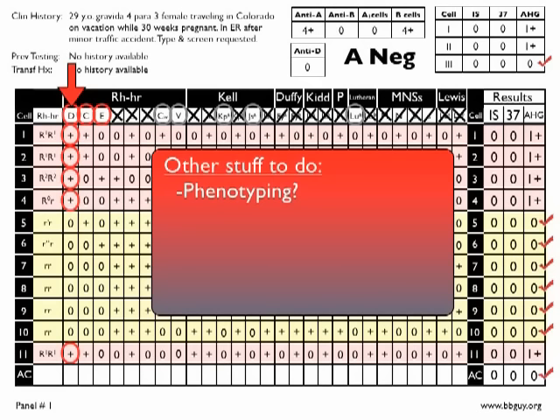In other words, obviously, you know what the phenotype of this individual is for D, because duh, the person is group A negative. But you might phenotype for big C and big E to kind of see what the deal is with them as far as the likelihood of them having a different antibody. So you might do that. You probably wouldn't in most cases. You would have to do some selected cells to rule out the other antibodies. In other words, you would want to do some cells that have varying combinations of big D, big C, and big E, so you can rule out big C and big E.